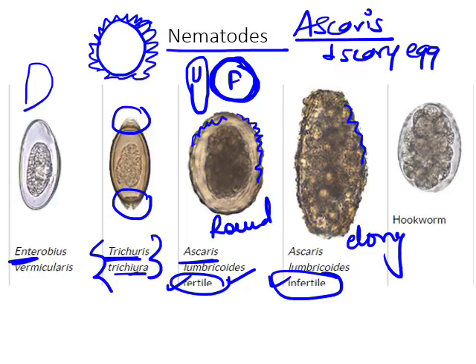Fertile egg will have a thicker cortex or shell, the opposite in unfertile. So that is how we differentiate Ascaris. Remember, Ascaris is scary, that is tuberculated or bumpy surface. Now hookworm, what did we see for hookworm? It has a segmented egg and we use hooks to clear the space. So that is where we see this segmented ovum and there is a clear space between the egg and the shell.